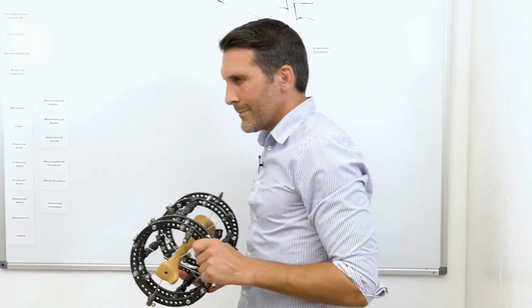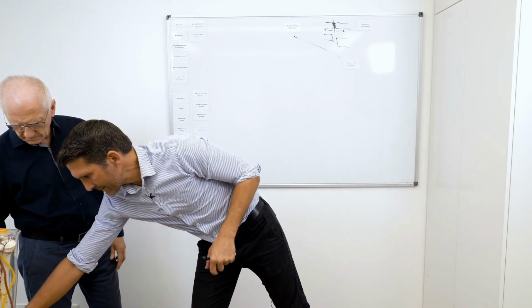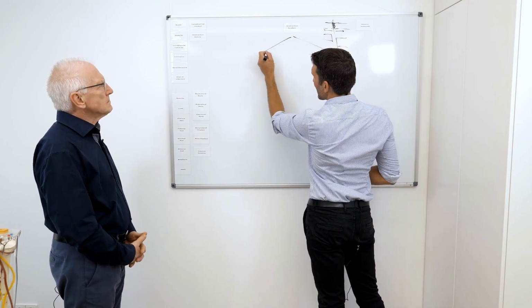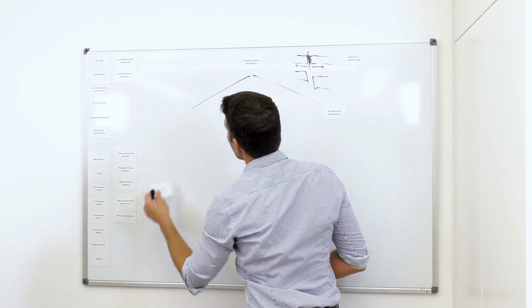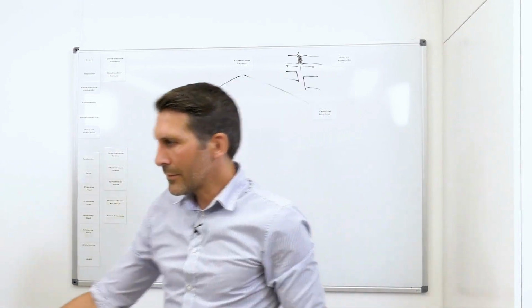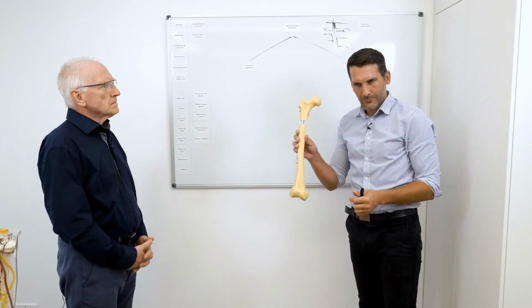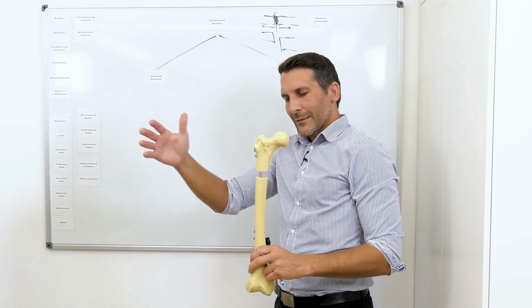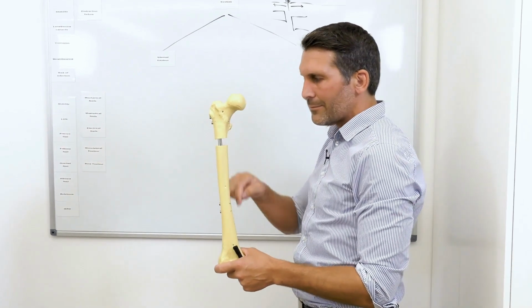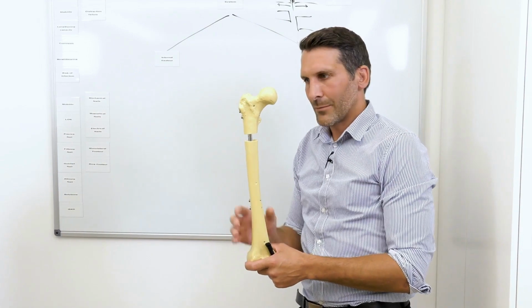So, we then have our internal fixators. The second group is you can also stabilize the whole thing, not through external force application, but through internal force application. That means here we have a thigh bone, for example. Now we don't have an apparatus around the outside to stabilize everything, but we have a structure in the medullary cavity that is supposed to stabilize the area.